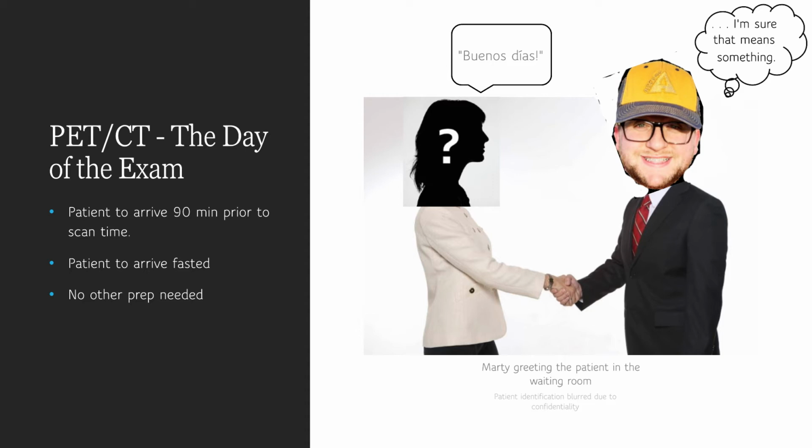I greeted the patient in the waiting area, where I quickly discovered that my first complication, in quotations, of the study was present. The patient only spoke Spanish, though she did seem to understand English, thankfully. She verified her identity by giving me her last name and her birth date, and then I escorted her to one of the injection rooms and proceeded to ask the following questions.